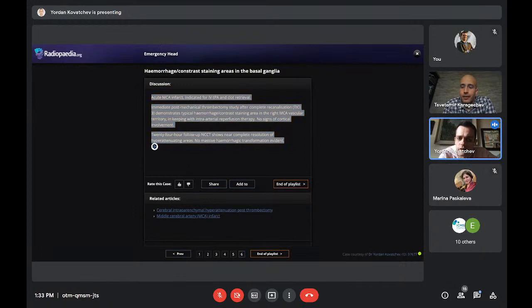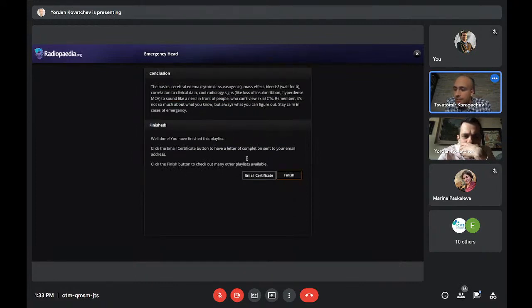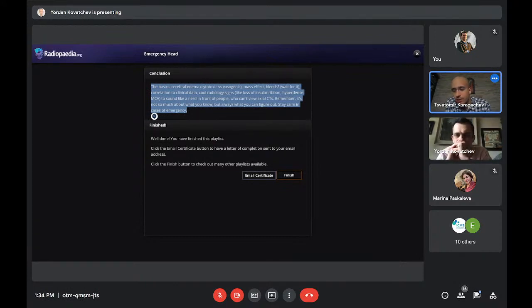I think, was that the last slide? Thank you very much, Dr. Kovatchev. This is actually a great case that my colleague presented to you. It's something that we don't see every day, that has confused us, and it gets to confuse people in common, because mechanical thrombectomy, we won't go into details, but it's actually something that's pretty new from this century, and these kind of cases tend to be recognized in the last couple of years more and more, because many more mechanical procedures are performed also here in Bulgaria.